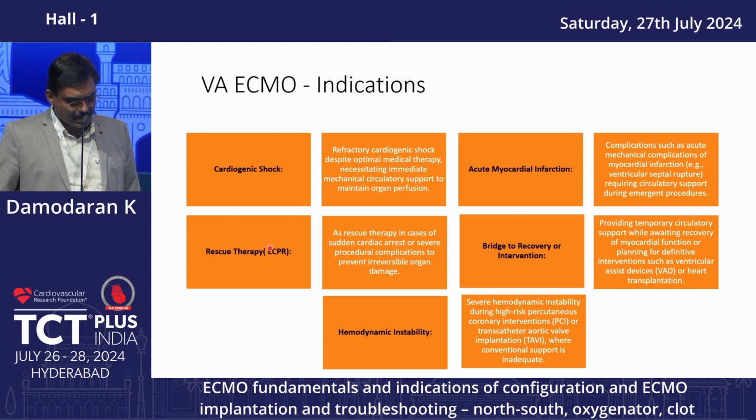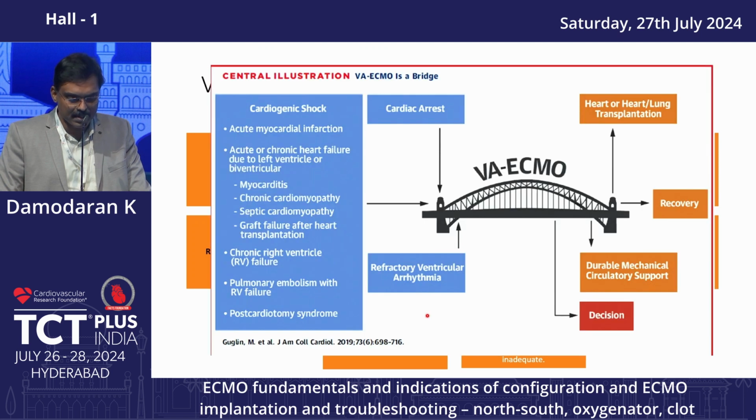Witnessed cardiac arrest or in-hospital arrest, if we do proper ECMO-supported CPR, we can get almost 29% survival rate as per the literature, and also bridge to recovery and intervention. Mostly the advanced heart failure transplant team uses this as a bridge device. And the last one, though not much robust data, there are some single-center registries which say that even in patients with high-risk PCI, like a last remaining vessel with adverse hemodynamic features, you can use that.